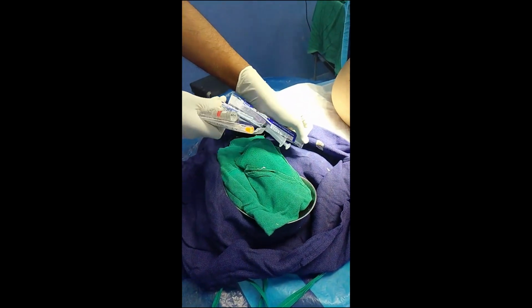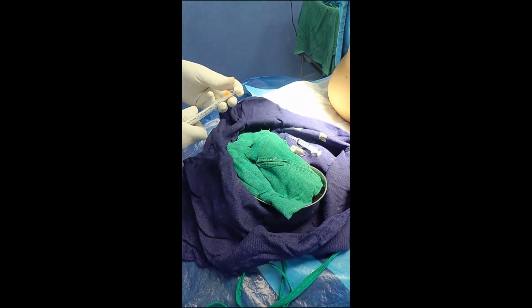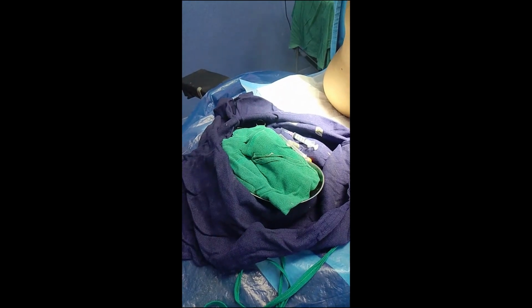So today I am going to teach you a spinal anesthesia procedure for an obese patient, and I am going to give a spinal anesthesia for an obese patient here in the C-section procedure. Now let's start the procedure.